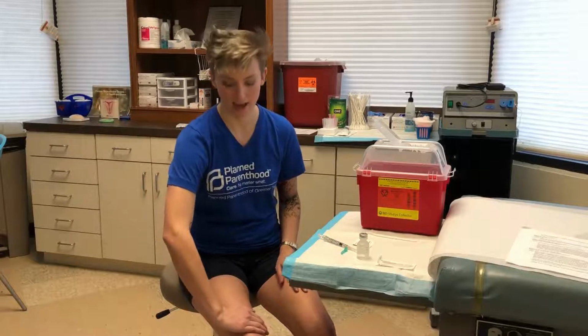Now that your medication is ready, you're going to get your injection site ready. For performing subcutaneous injections, we perform this injection on the top of the thigh. So take the edge of one hand and place it at the top of your kneecap. Then your second hand on top of that one, and then that first hand on top of that one. Where that third hand is on the top of the thigh is where you will perform your injection.